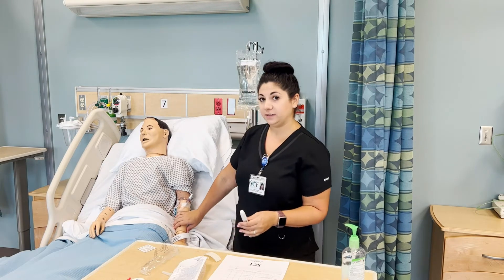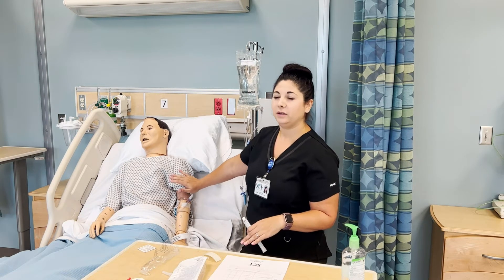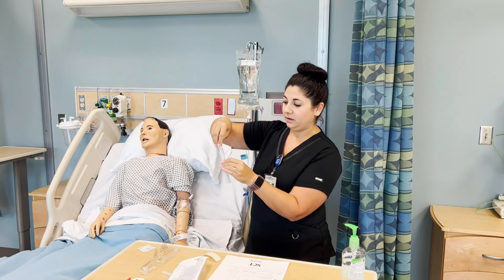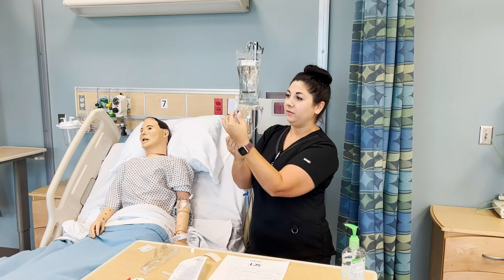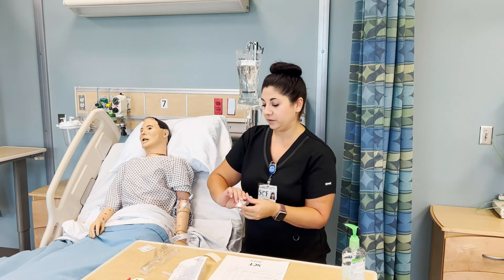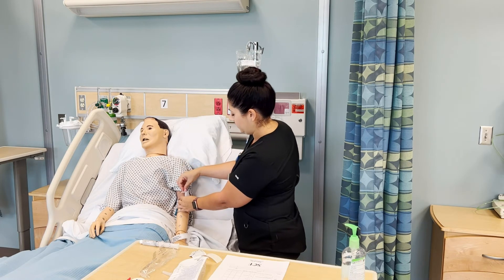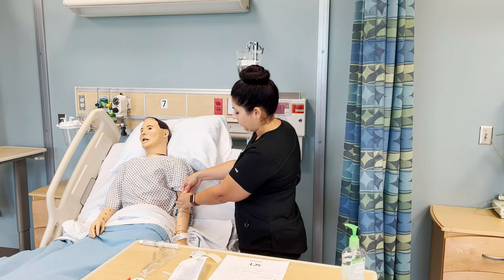We are going to assess our patient's IV site, checking to make sure that it's intact, that it's not leaking. I'm going to feel their arm to see if there's any reddened areas or warmth, and ask the patient if it hurts at all. Next we will get our flush ready — sometimes you need to pull these down to pop the air seal. Take off this top and leave it with the open part up on the table. Make sure you have all of the air out. Using an alcohol swab, we are going to clean this port for at least 15 seconds. I like to open the alcohol swab and drape it around so you're getting all sides. Make sure you're cleaning vigorously.